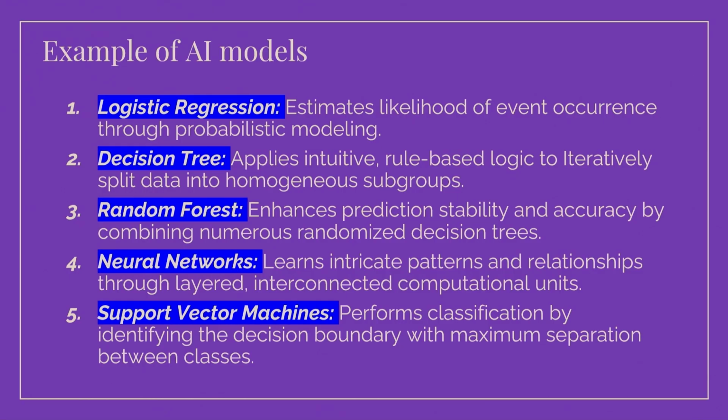All right. So for AI models, I have listed down here a lot of different models. For example, I just talked about the first two, logistic regression. Logistic regression is a basic mathematical equation, like y equals a x plus b x plus c x, everything added or subtracted together, with different weightage. So just like I use Cantonese to express this: 我今日食咗飯未？你估下？早餐。You make a prediction whether I have had my breakfast or not.